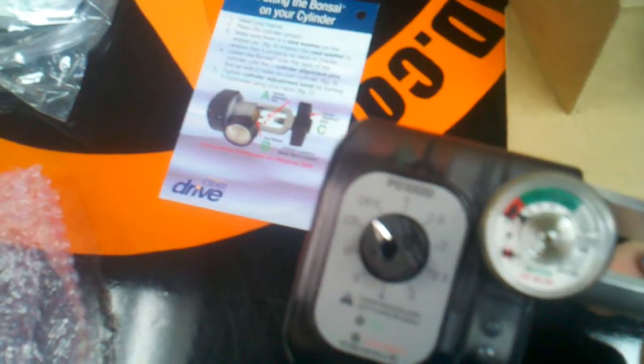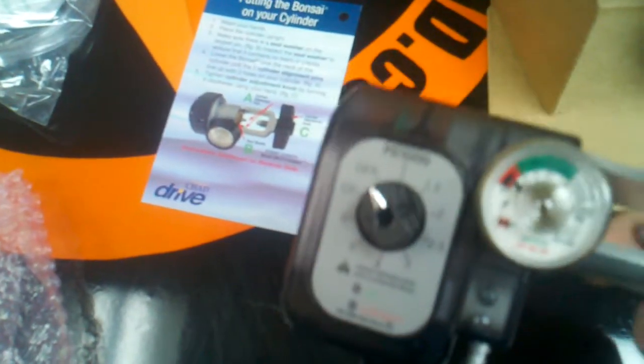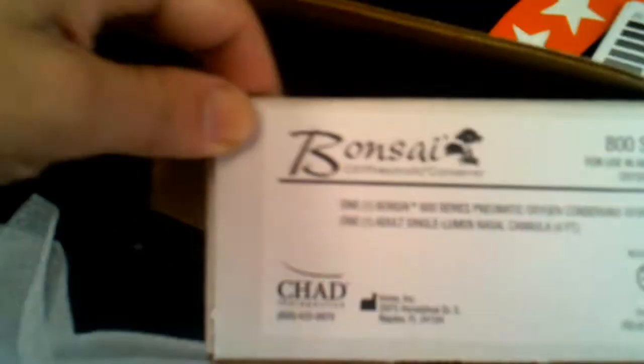And this is a single lumen. I've had nothing but great responses and a lot of happy people ordering this one. Now, if you want another version of a conserving device which is used to obviously conserve your oxygen, we're very proud to have this product. In fact, this is my personal favorite and this is the box it comes in.